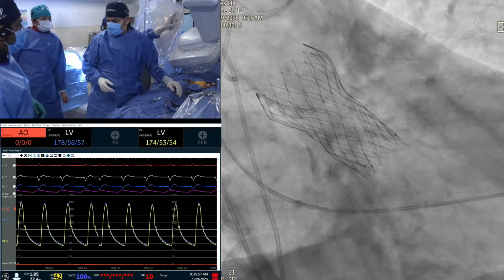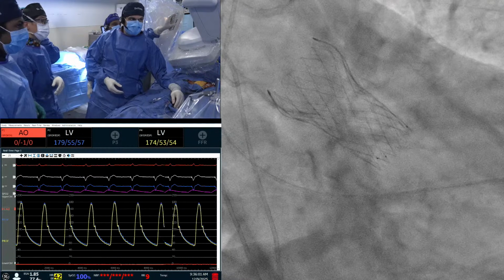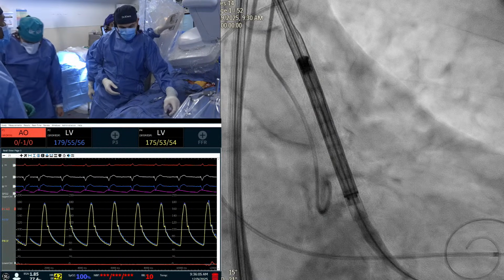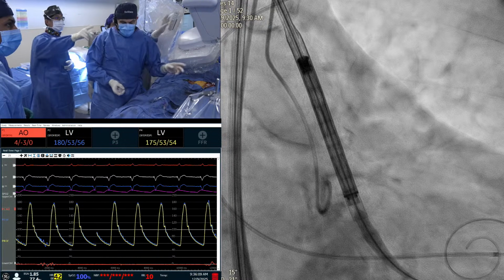I think he's asking about the technique itself, the technique of the valve commissure alignment. To get there, you basically flush for 3 o'clock, sometimes 1 o'clock. But the head marker you see here, actually show this, Dr. Sharma. This is the cusp overlap view.